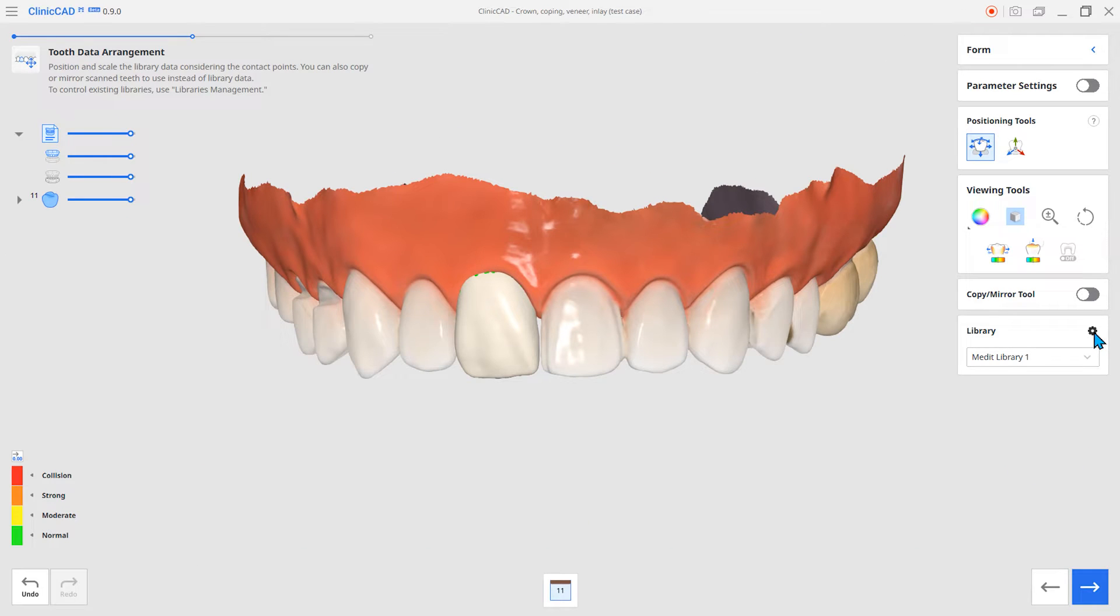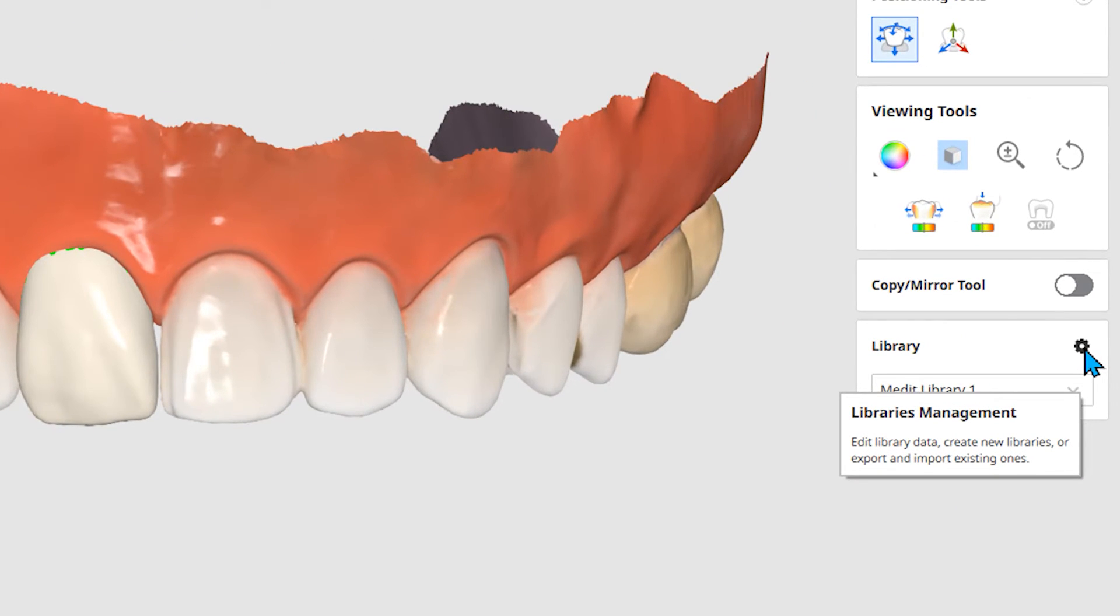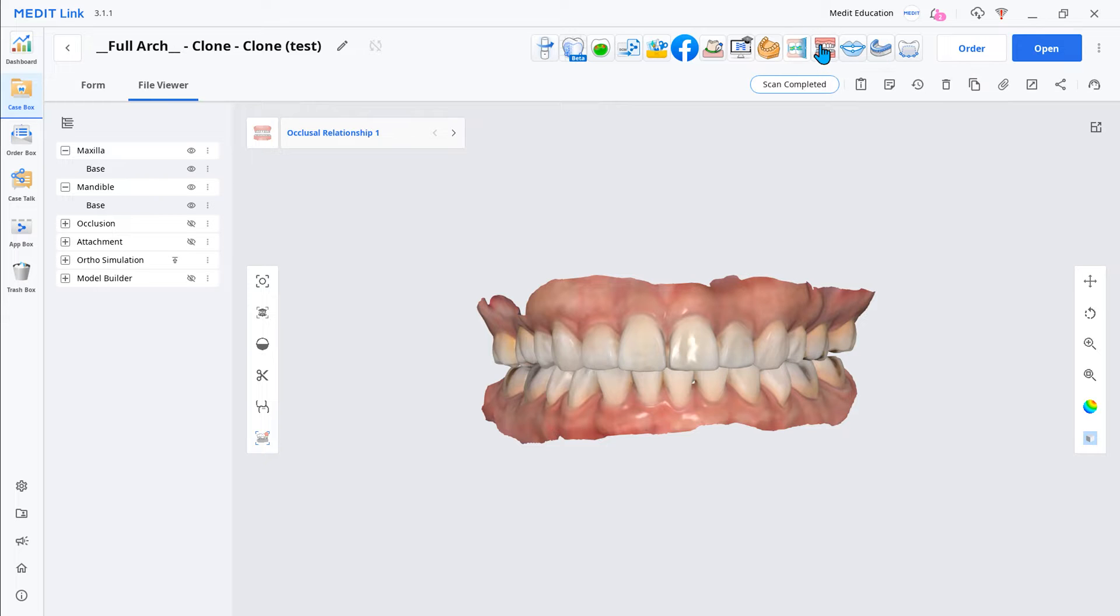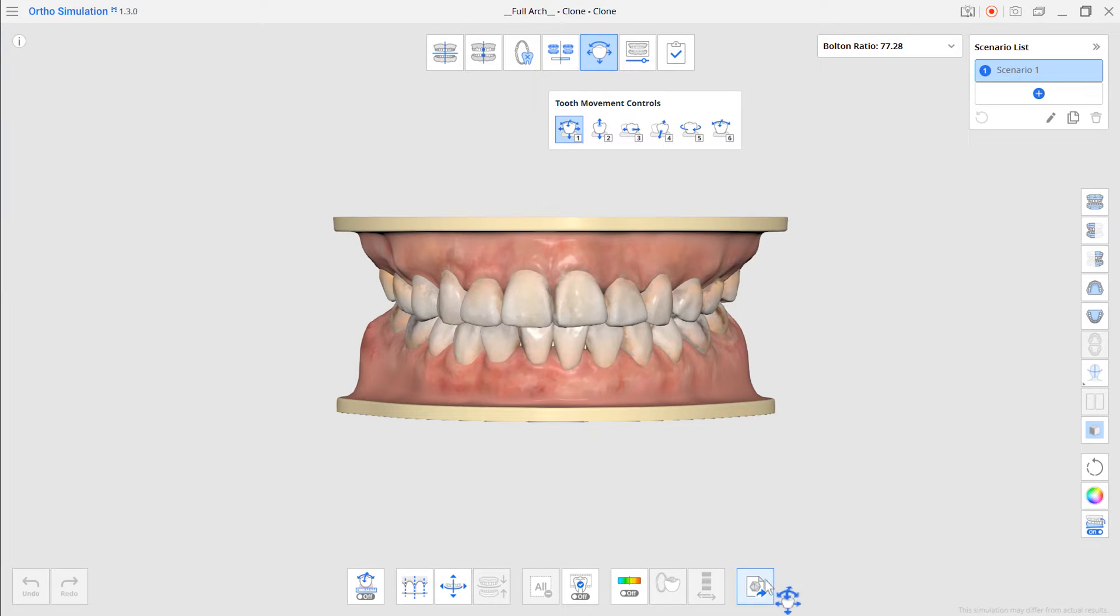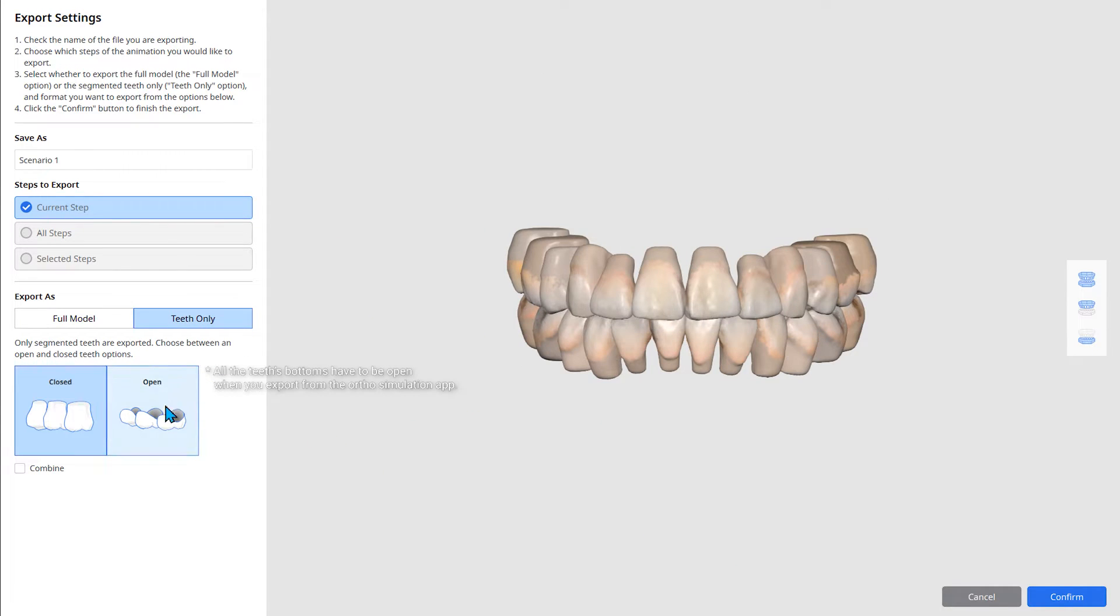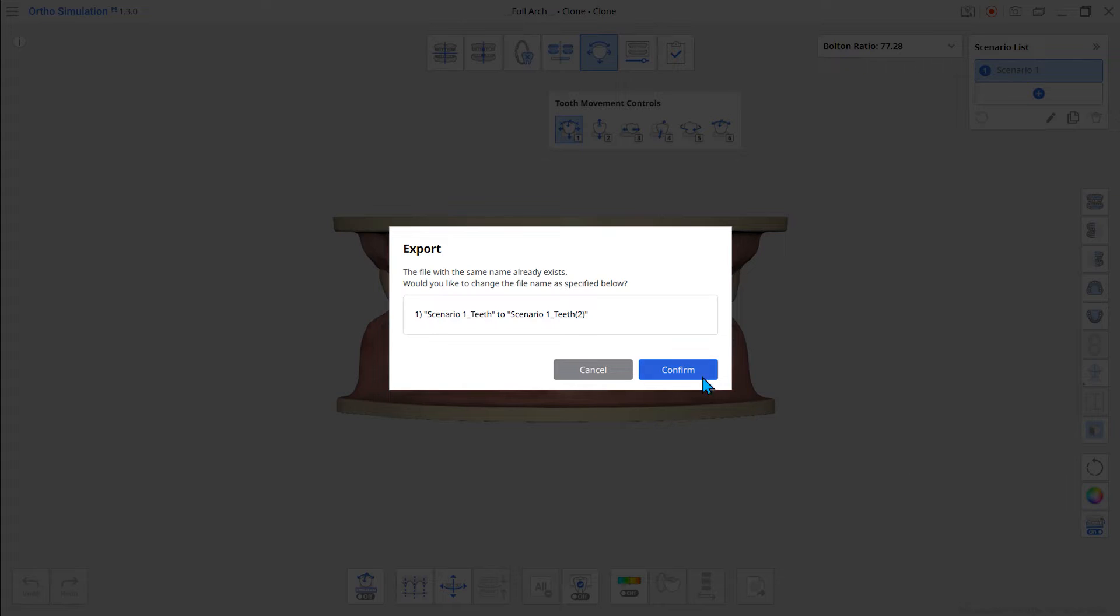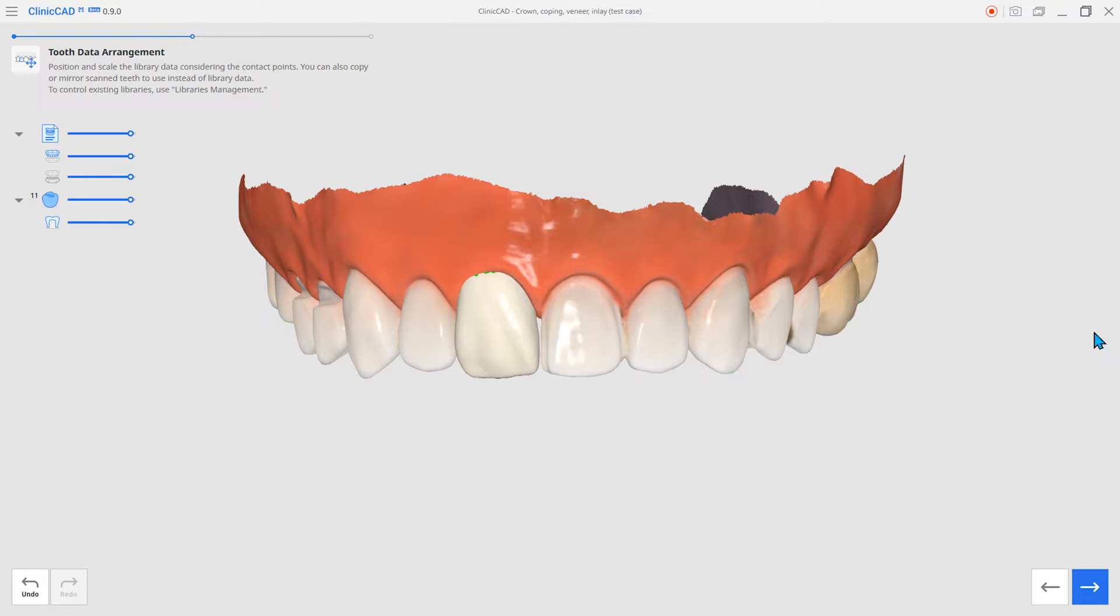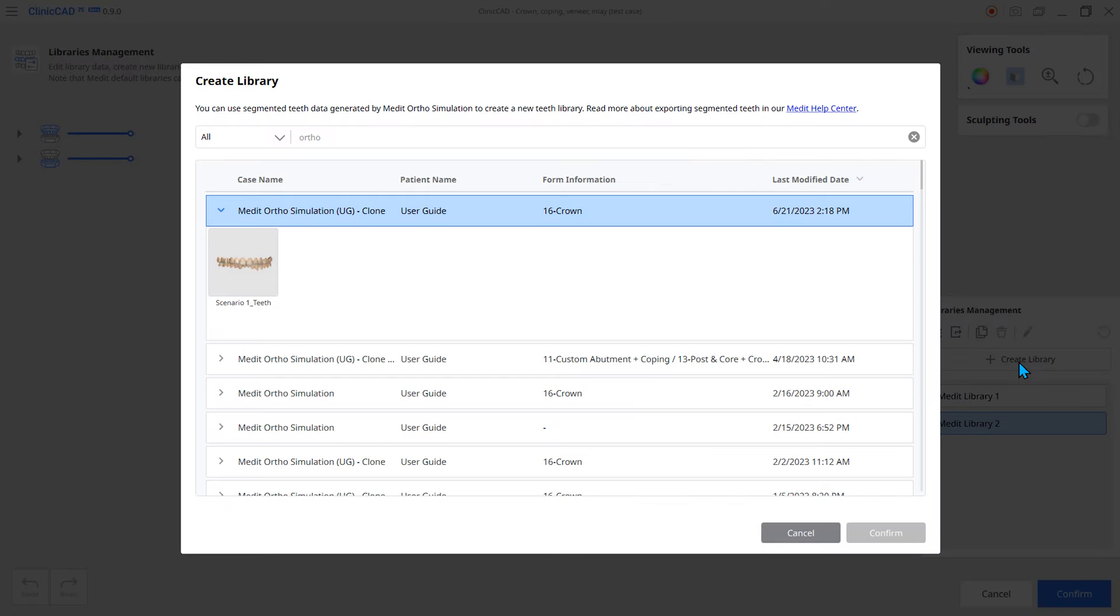The next one is the Teeth Library Management features. You can register and edit your own tooth libraries from your scan data. Load your scan files to the ortho simulation and export the segmented teeth. Once you have exported the data, it can be imported and used as a tooth library into Medit ClinicCAD.